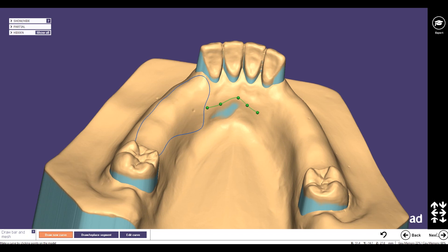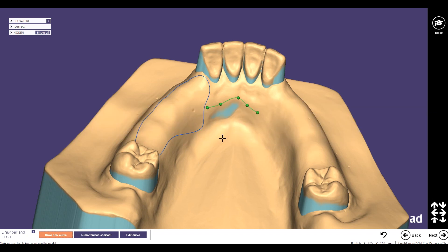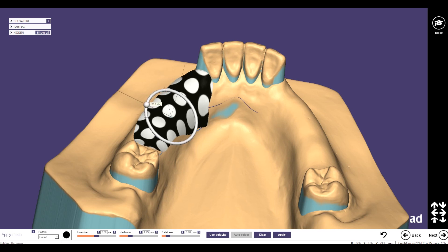First, I'll show you the classic way. We make the hole size at round about five millimeters, mesh wax round about one point two five, and the relief wax zero point six.